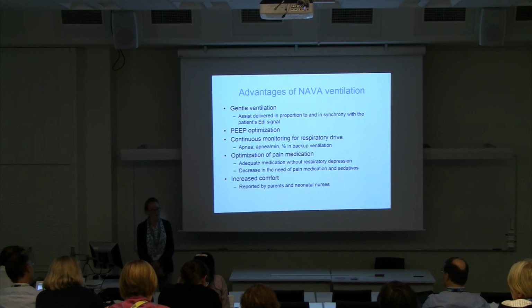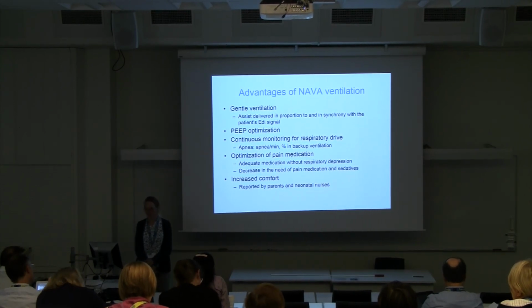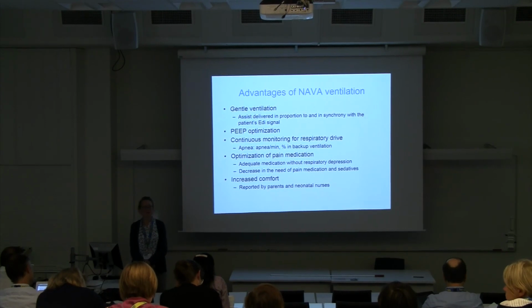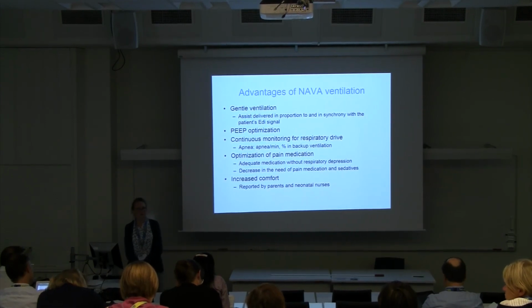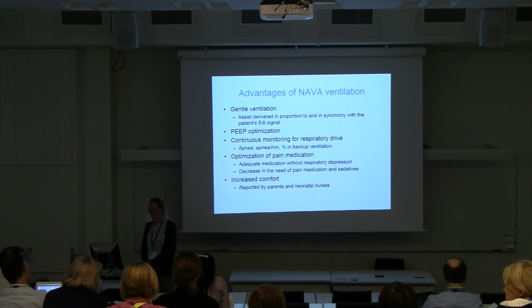And we can optimize the pain medication to give adequate medication without any respiratory depression and decrease the need for sedatives. And the last but really not the least is that we can increase comfort for these patients, and this has been reported to us by both the parents and the neonatal nurses.